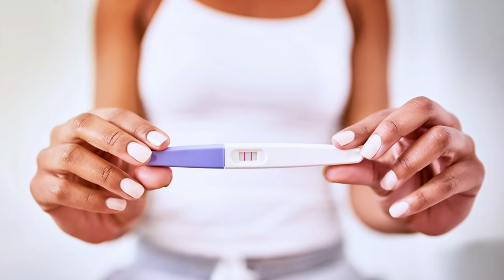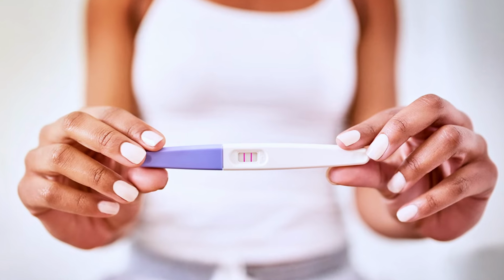Now, if the concentration of this hormone in your urine is not high enough, the pregnancy test kit will not detect it. So imagine if you test too early in your cycle. Of course, the concentration of the beta HCG will be low. So most pregnancy test kits cannot pick it. A few will say they are really sensitive and they can pick it, right? But that's just a few. And even with those, you still get false negatives. And that's something you don't want at this time. So please, if you use those early pregnancy test kits that say they can detect it before you miss your period, always repeat your pregnancy test after a missed period.